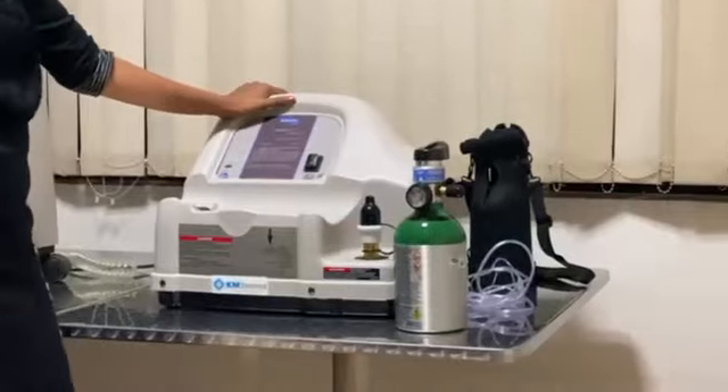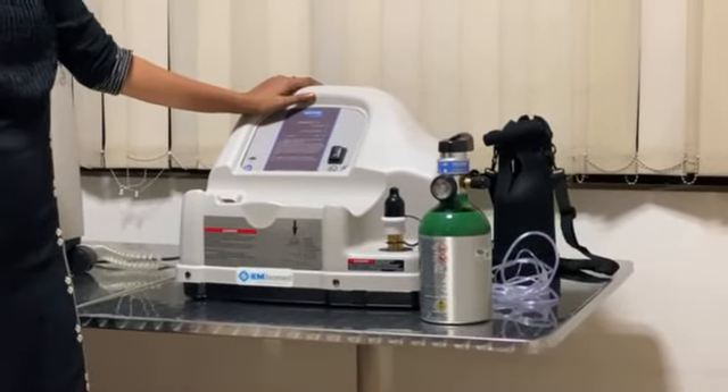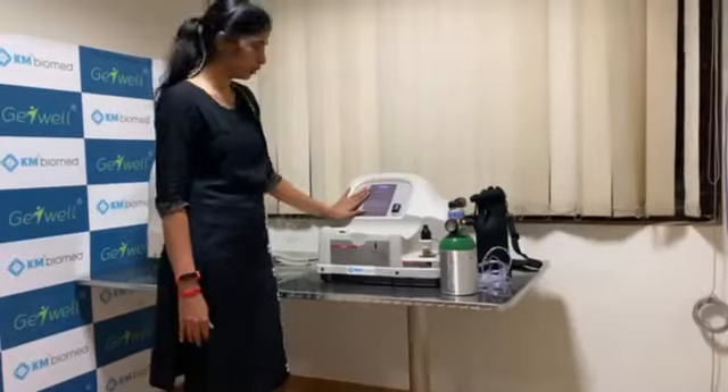When we come to the home fill system, this is mainly designed to fill the cylinders at our convenience. We need not go to a refiller or face any other difficulties. This is mainly designed for that purpose.